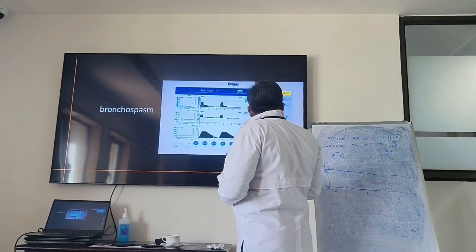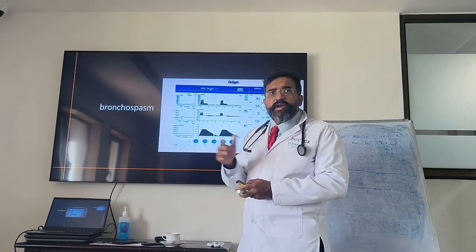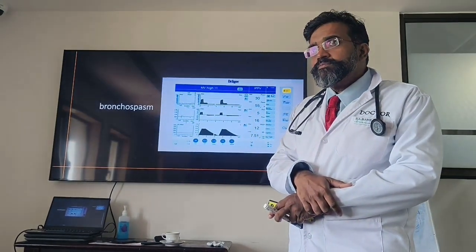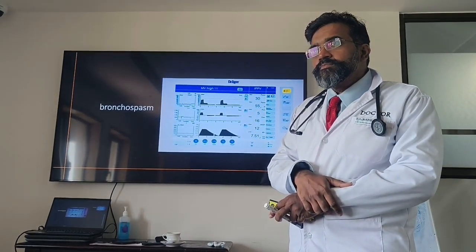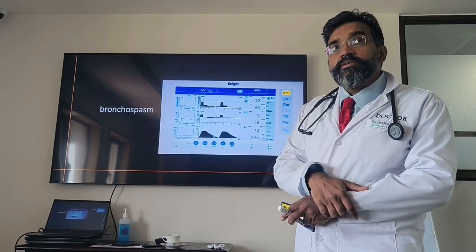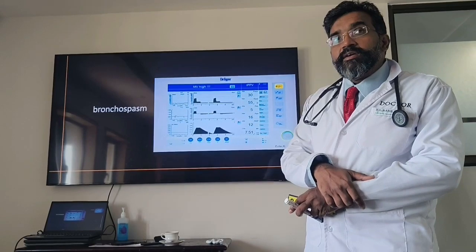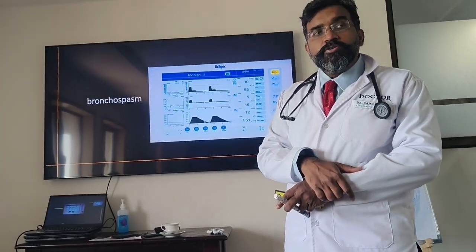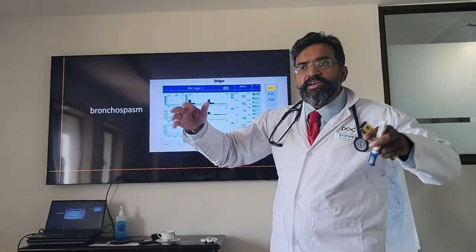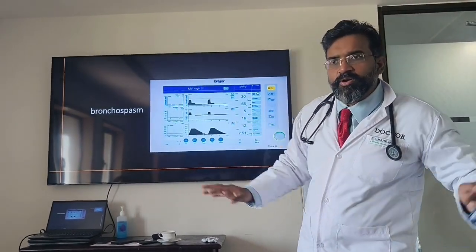What is the other difference you're getting? What is the other difference you're getting? Expiratory flow. So the amount of time required to expire has actually gone up, prolonged.